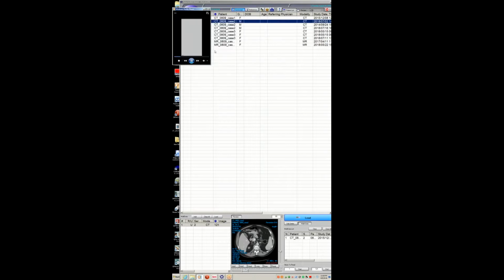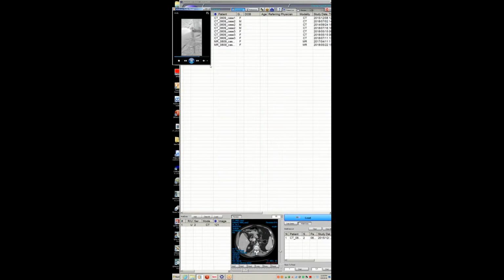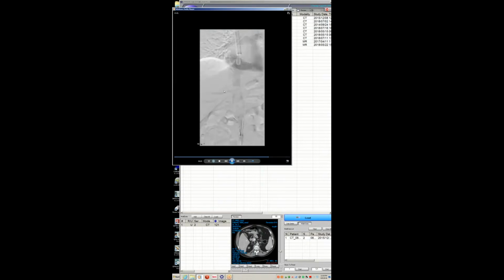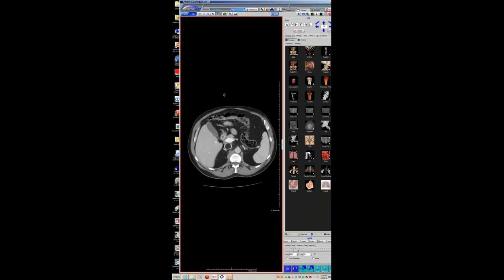So this is a guy who had an IVC lipoma, and the IVC lipoma had been growing, and it wasn't really causing any symptoms, but it was growing. And you can see here, they're trying to snag this thing, and they tried for a while to get it, and they had trouble getting it, and they eventually just got around it and pulled on it, and unfortunately, here's a CT of it, it didn't stay together in one piece. So here it is before, see this large intracaval lipoma.